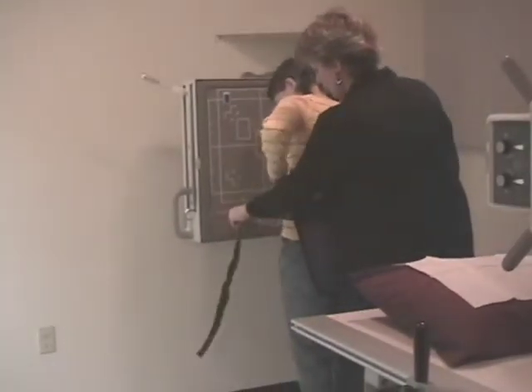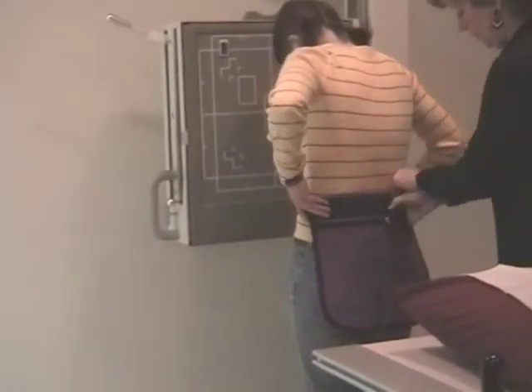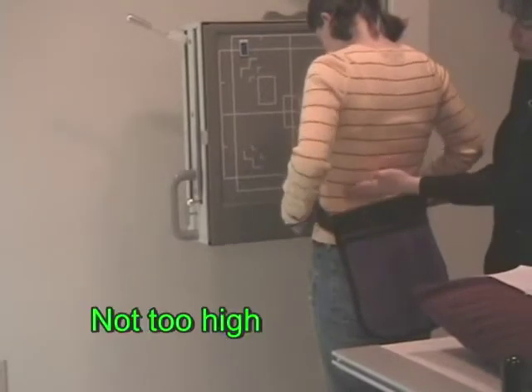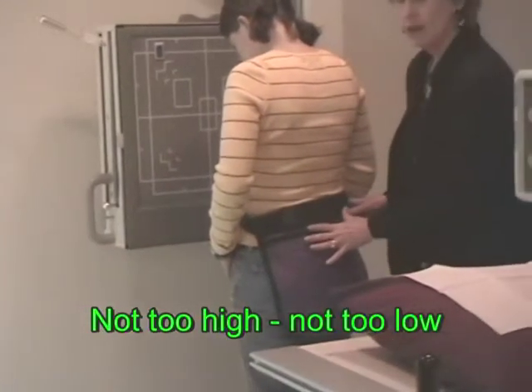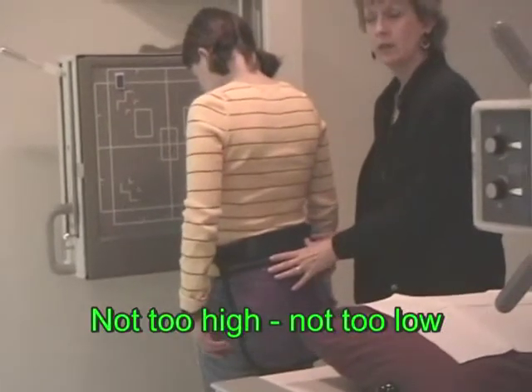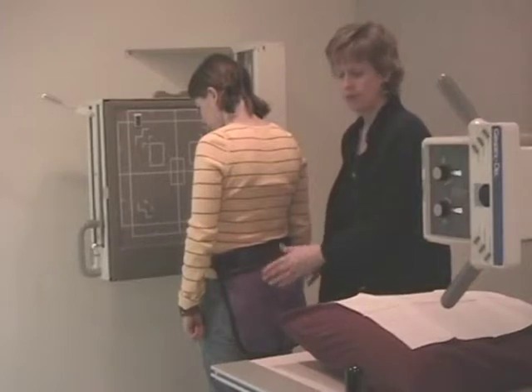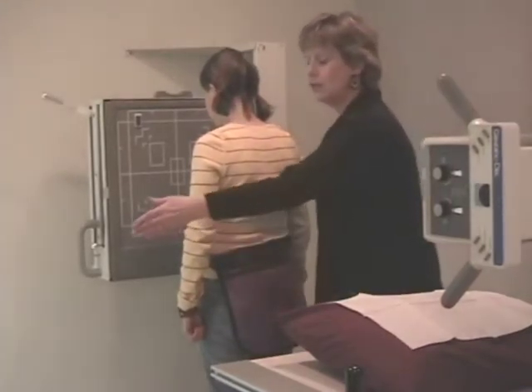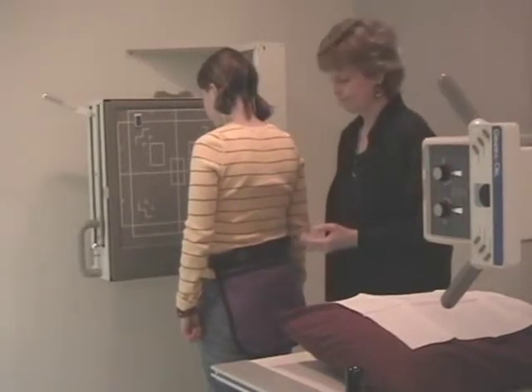And this happens to be an apron that's very convenient, and it's Velcroed. And it can just hold there. I verify that it's not too high up into the lung field, nor is it too low. It is covering the reproductive organs. Many hospitals have a tripod type device with a lead apron that's actually hanging from the tripod, and you move the tripod in to protect the reproductive organs. Okay.